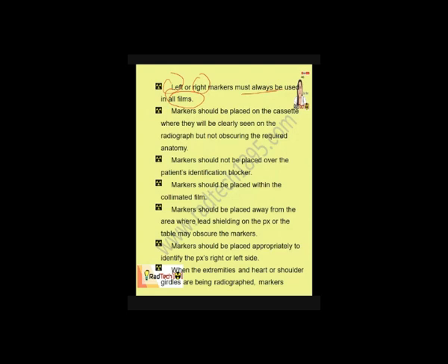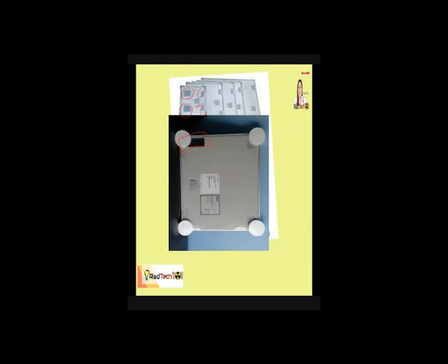On our previous slide, I presented the radiographic cassette with markers. And always remember that the marker of the cassette must always be on the right side of the patient. So let's go back to the previous slide. When we position this cassette, this is the back part. The front part is not that visible, but it also has a mark, like a label.